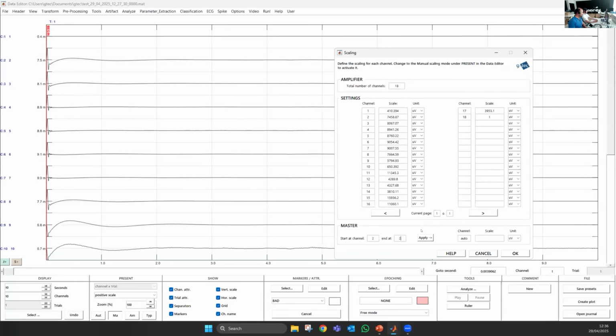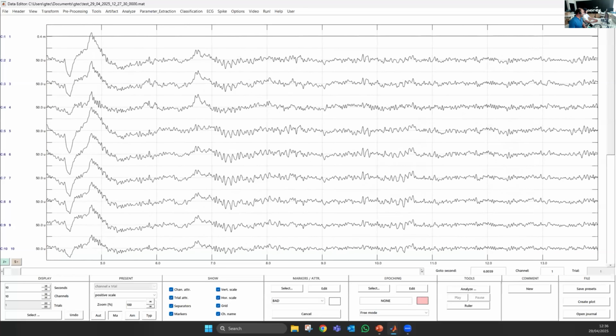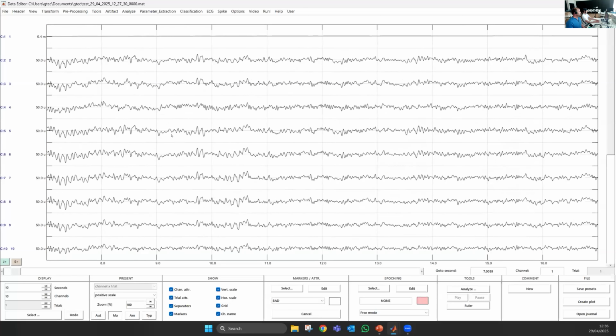What I will do shortly, so that you see the signals, is apply a different scaling for those, because then we also see some signals. Now you can do, of course, a lot of processing steps in the software. What we also provide with the software is a so-called batch mode or script mode, where you can define scripts and run them automatically with all the functions that you want to include in your processing. So it's not necessary to do all the steps one by one. With the scripts, you can easily do that.